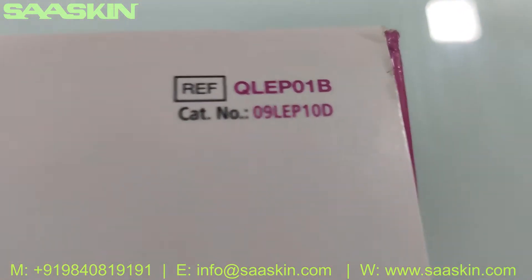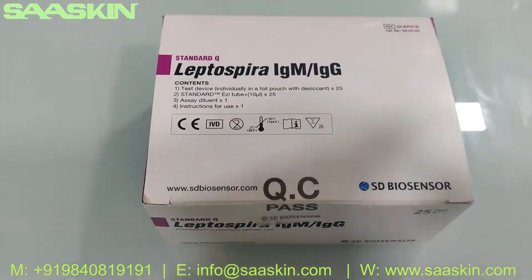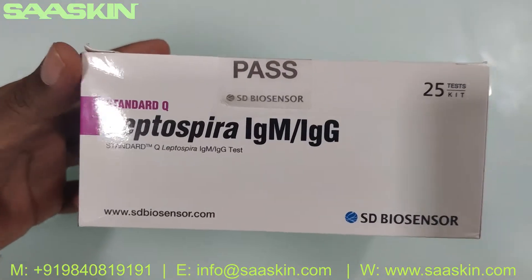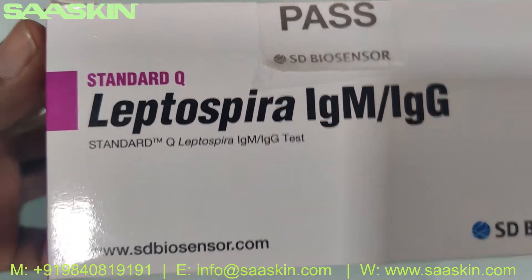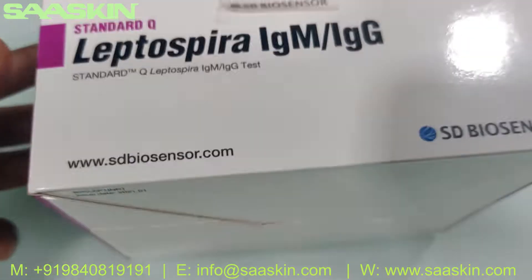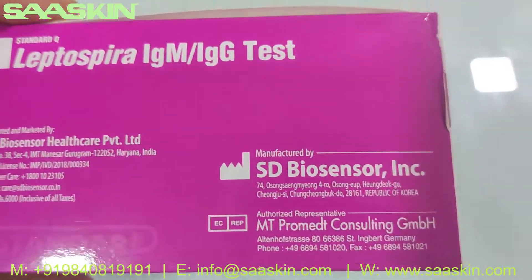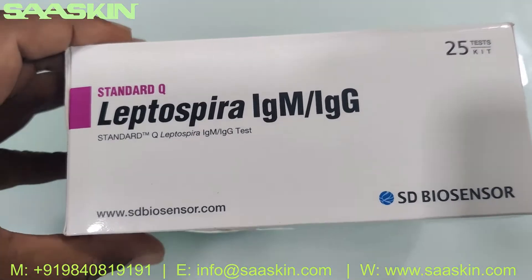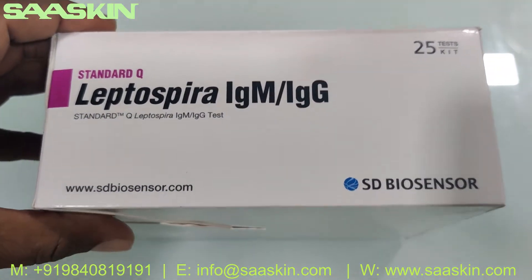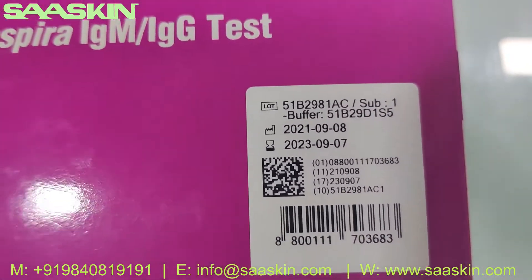You can see the reference part number here. This is the 24 test kit pack — you can see around the box. It says Standard Q Leptospira IgM IgG test. It's manufactured by SD Biosensor Korea. This is how the box looks like, with a standard 2 years of validity.